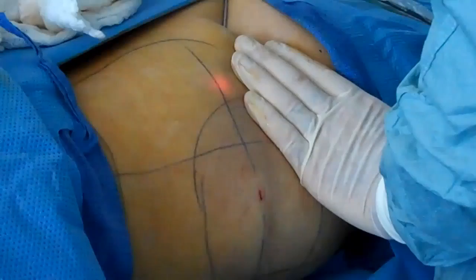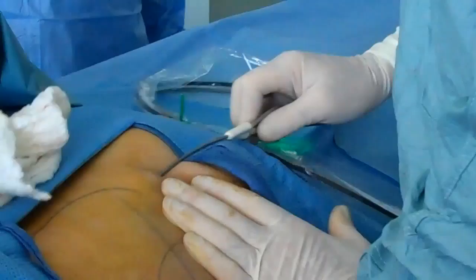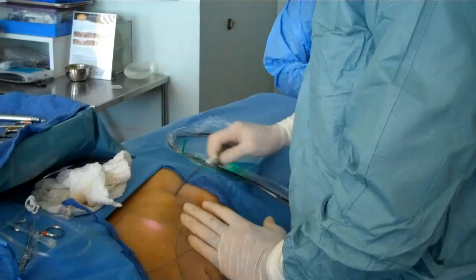There's a nice temperature probe on the end of this laser cannula that measures our temperature — this is the skin tightening. We have to make little access incisions — a little cut here and a little one over here. We're going to leave tiny little scars, so we put them in areas where you can't see them.